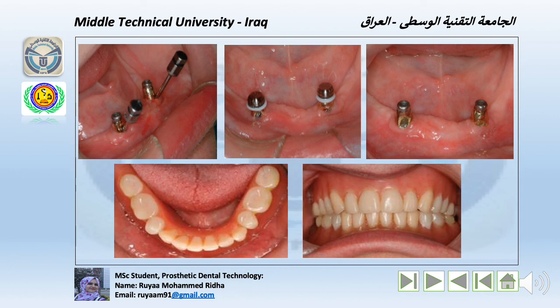The gingival tissue responded well to the corrected angulation and appears healthy with approximately 1 millimeter of attached mucosa on the facial surface, as shown in the picture. The occlusal view of the mandibular denture in place, and this final picture shows the facial view of the denture in full occlusion after treating the angulation of the abutment.